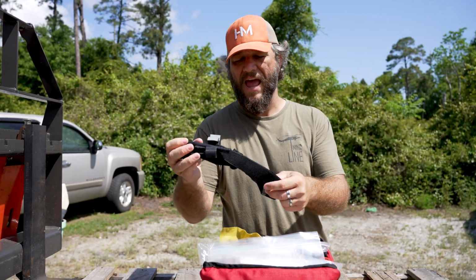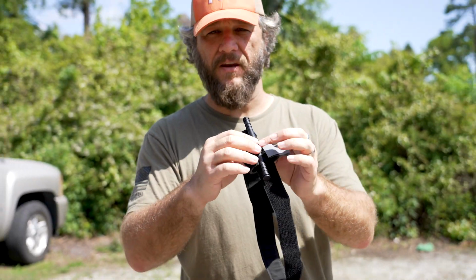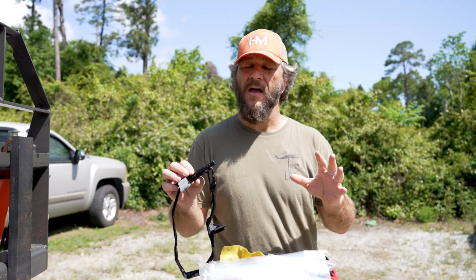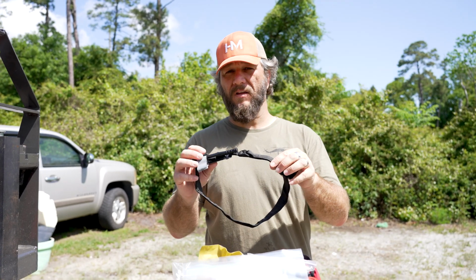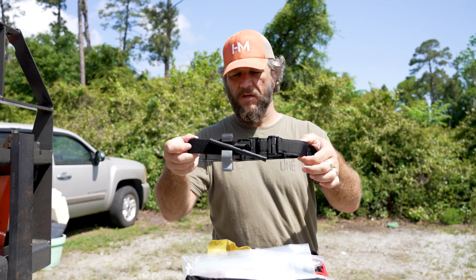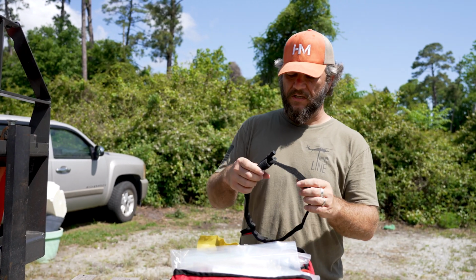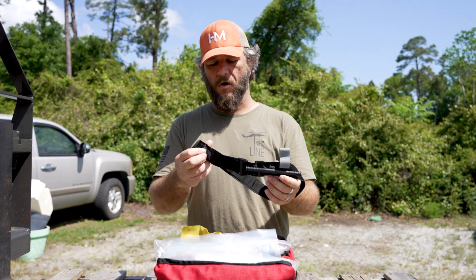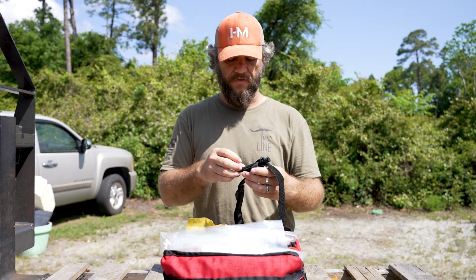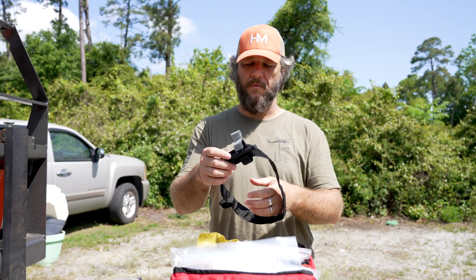Next thing is a CAT tourniquet. This is probably one of the most important things to have in here. Even if you don't have an entire emergency medical bag, if you only get one thing, this should probably be what you get, a CAT tourniquet. And I'm not going to explain how to use these, but what is really good about these is that one person can use them on themselves very easily.